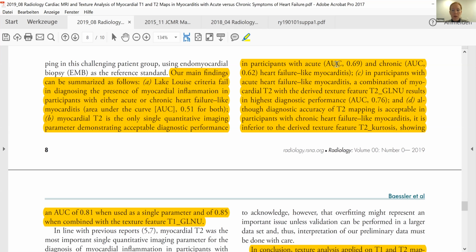And we tried it in patients with HCM, because it's the same hypothesis. There is some inhomogeneity, some tissue structural abnormality, which we can get by LGE, but sometimes you don't want to give contrast, or you are not able to because of kidney disease or whatever. So we used not mapping, but native T1 weighted imaging, and it also turned out that we could detect LGE on native sequences, or at least something which is potentially reflected on LGE. Yeah, and other groups did several different cardiomyopathies as well.